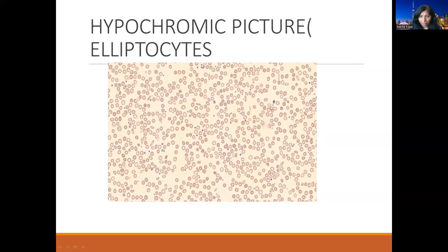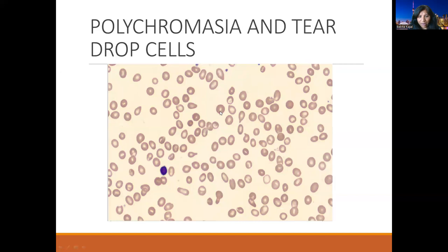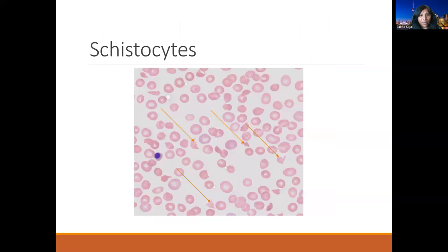These RBCs are a bit bigger and have reduced central pallor. These cells also show tear drop formations, so this is probably indicating some kind of myelofibrosis or bone marrow infiltration.